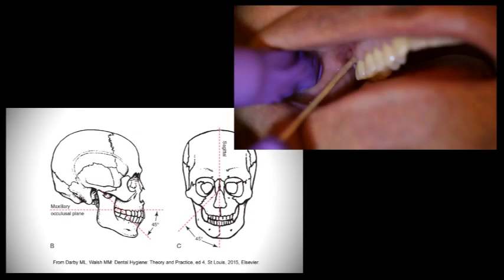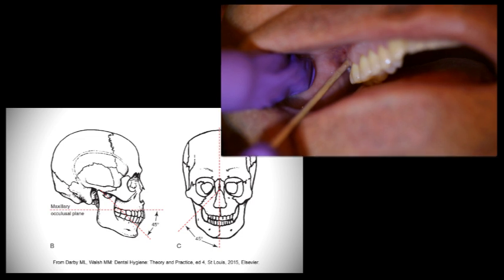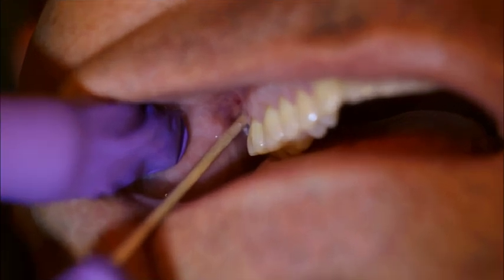The angulation of the needle should be upward or superiorly at a 45-degree angle to the occlusal plane, inward or medially at a 45-degree angle to the occlusal plane, and backward or posteriorly from the mid-sagittal plane at a 45-degree angle to the long axis of the maxillary second molar. The insertion point is distal to the zygomatic process at the height of the mucobuccal fold of the maxillary second molar using all of these angulations.